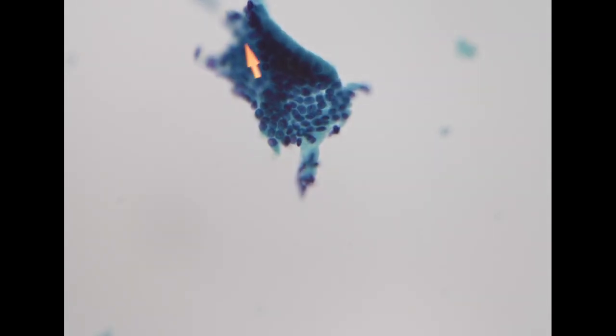The nuclei are small, regular, and with a honeycombing arrangement. On the other hand, here there were a few very scattered, larger cellular fragments with more enlarged nuclei.